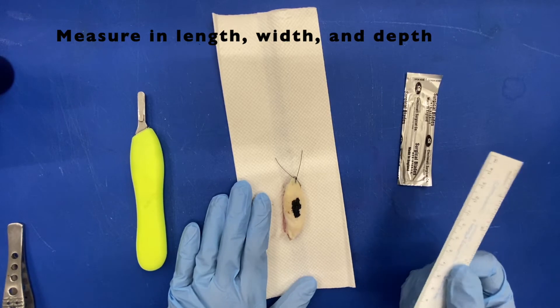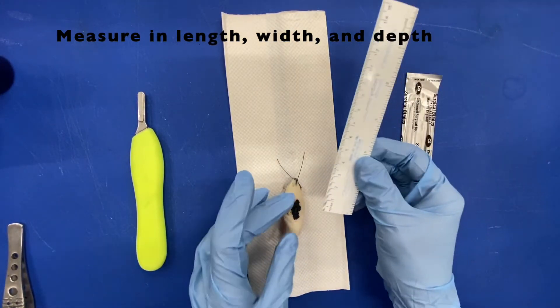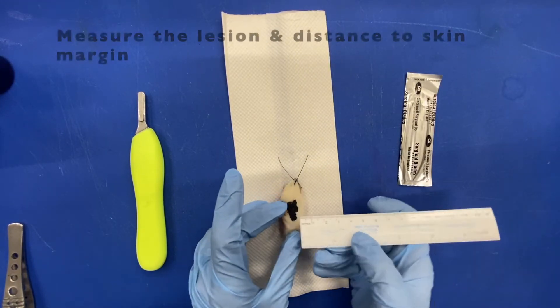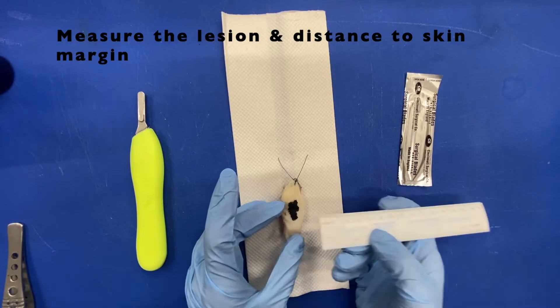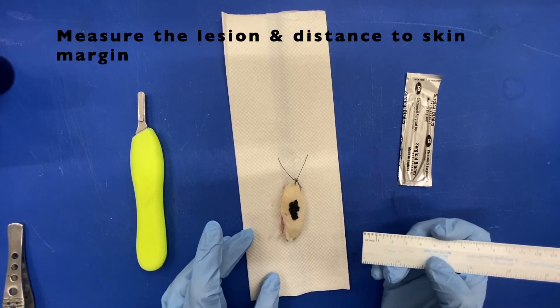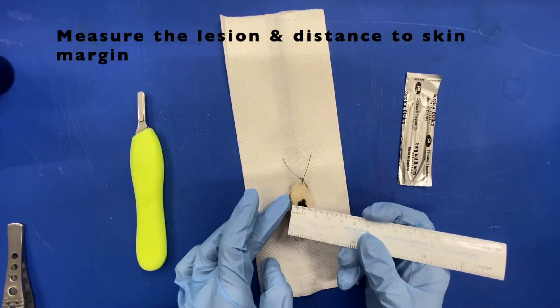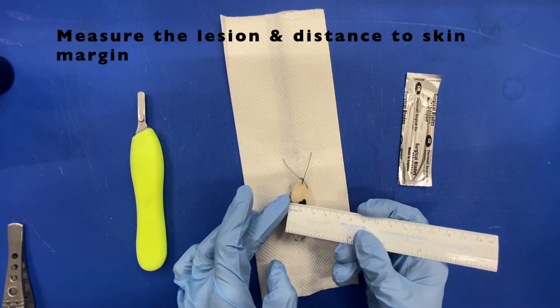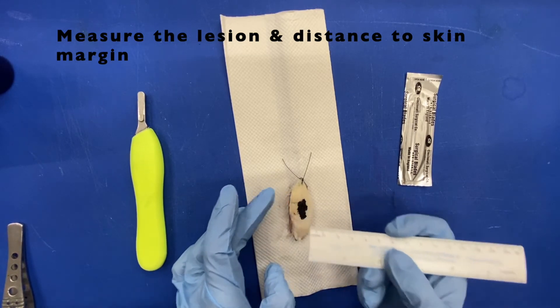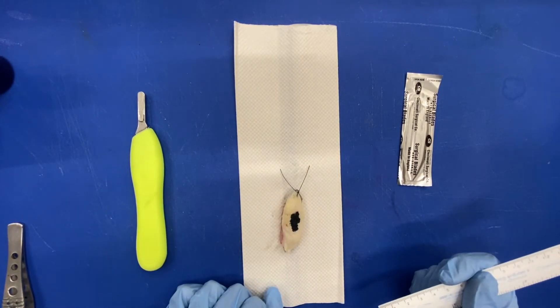Close parenthesis with a brown-black ill-defined lesion, 0.8 centimeters from the 10 o'clock margin close parenthesis period.